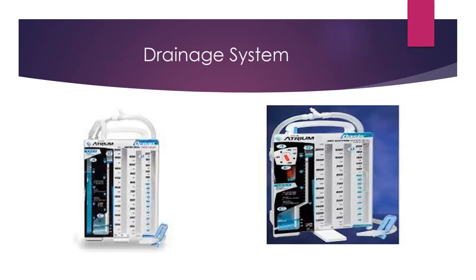Let's take a look at the two drainage systems — we have something called a wet seal and a dry seal. On the left is a classic wet seal and on the right is a classic dry seal. If you notice the very left of both chambers, one has water filled up in blue and this one has a dial — that is the difference. They both still have what's called a water seal chamber. This is a dry system and this is a wet system.